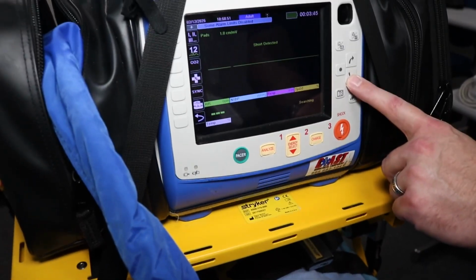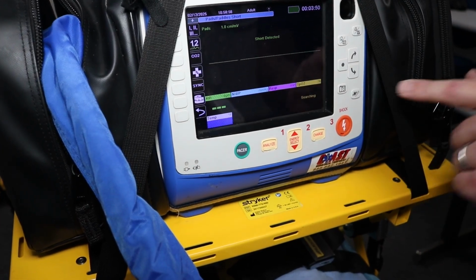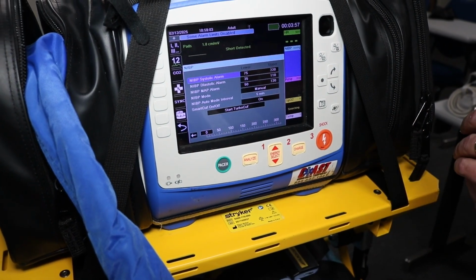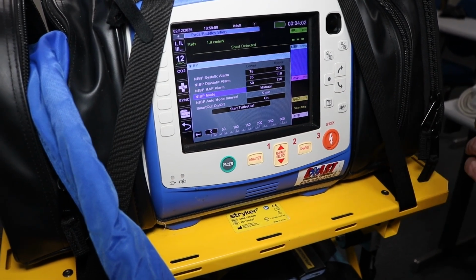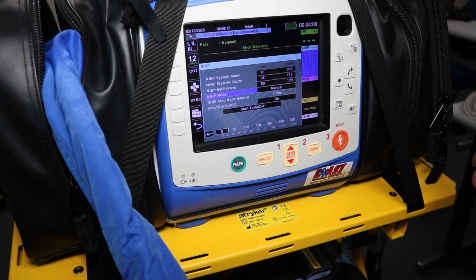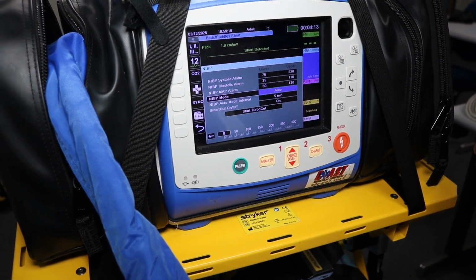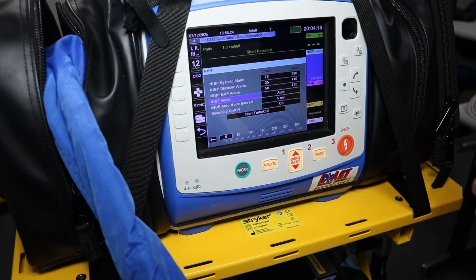I am going to cycle through, and you can see the cursor moving until we get to NIBP. Once NIBP is highlighted, we are going to select in there and scroll down to where it says NIBP mode. It defaults to manual, but we want to switch it to auto. So once you are there, you will hit the select button again and scroll down one time to auto. Once that is good, you will hit select again and it will stay in the auto.